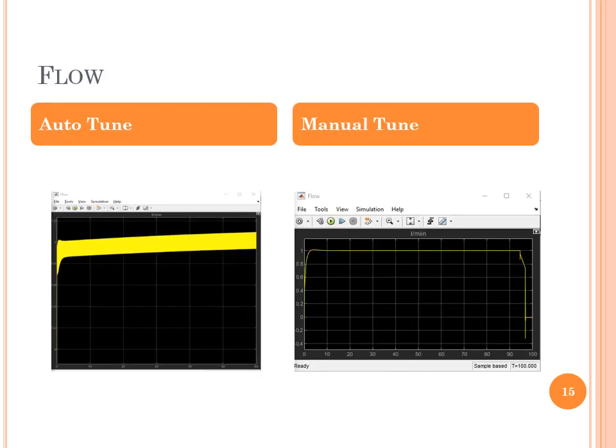As we see here, on the left side, the figure denotes the response of the flow PID controller with weights set using the Simulink auto-tuning tool. It shows some high-frequency oscillations, meaning the system is not stable, even though by averaging it shows a constant flow. Oscillation means the motor is turning on and off really fast, which is a physical problem and can damage the hardware and cause higher electrical power usage.